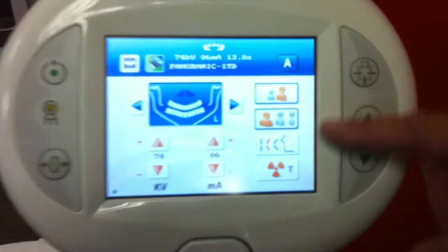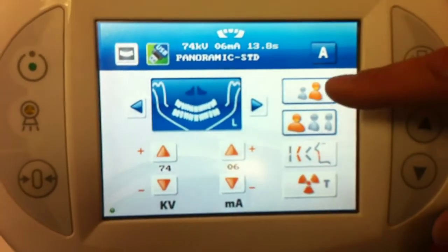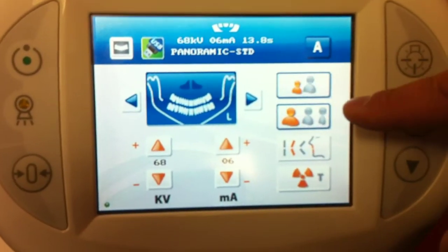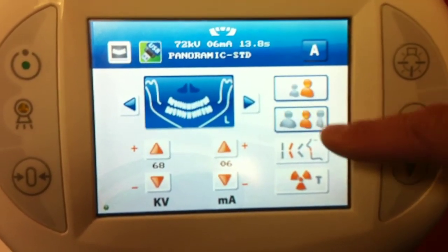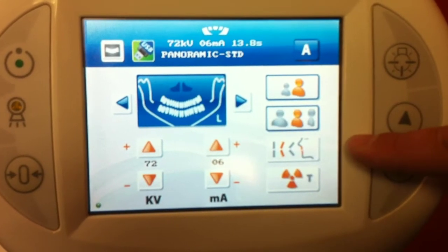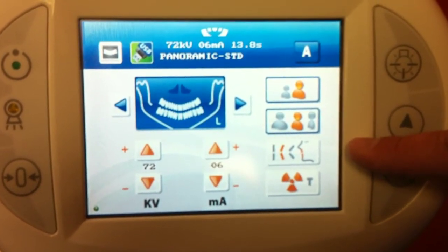Over here you select the basic information for the patient. You have adult and child settings, small, medium, and large. And here you select your anterior focal trough.